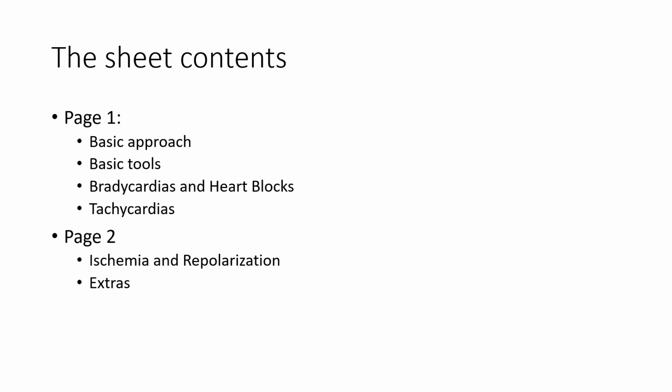The idea is less that you memorize the sheet and more that you internalize it by applying its contents to the task of interpreting and acting upon the ECGs we encounter in my lectures, if you're working on shift with me, or if you take the initiative to apply some of what I've discussed in this video to your own ECG interpreting life, wherever you may be.